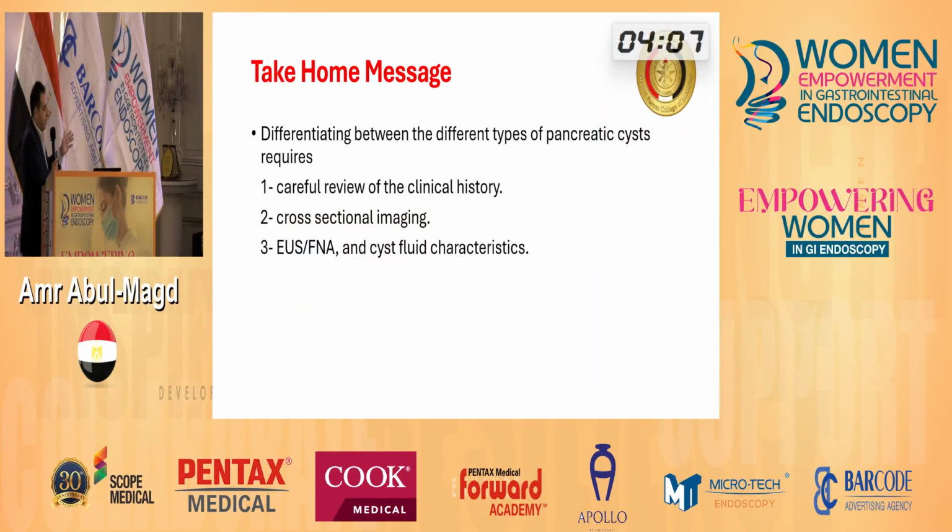In conclusion, differentiation between different types of pancreatic cyst is required. Careful review of clinical history and cross-sectional imaging may be helpful, but always trust your needle and cyst fluid analysis.